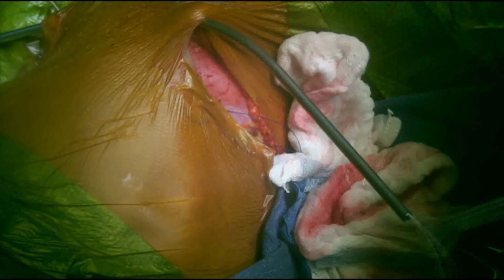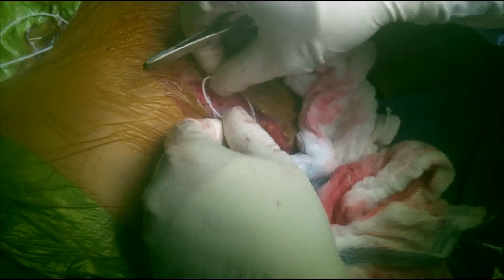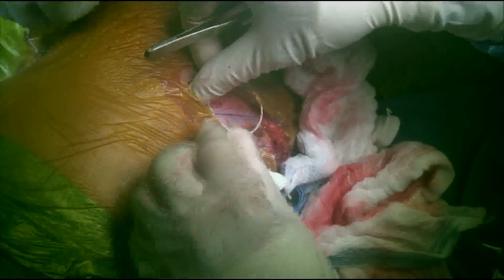It is important to remember that cutting of any extra length from the pump segment catheter or the spinal catheter can only be done at the site of the spinal wound. The surgeon should therefore be careful and ensure that there is enough length for the pump segment catheter at the abdominal side before cutting it at the spinal side.